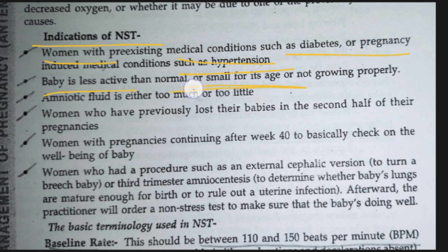And mainly if the baby is small, if the baby is not growing properly, for them also we advise to undergo this examination. And if the amniotic fluid is too little or too much, we will come to know by observing itself. If the womb is very big, that is, amniotic fluid is more. If the womb is very small compared to the months, then the amniotic fluid is less. Even in that condition, we will advise the mother to undergo NST.